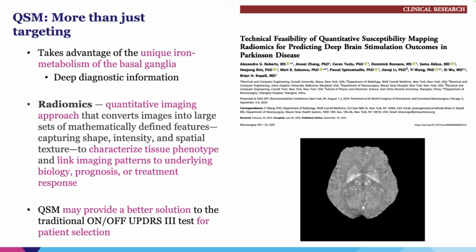It's a quantitative imaging approach that converts these large sets of images into large sets of defined features and essentially characterizes tissue phenotype, and it can link imaging patterns to underlying biology, both prognosis and treatment response.